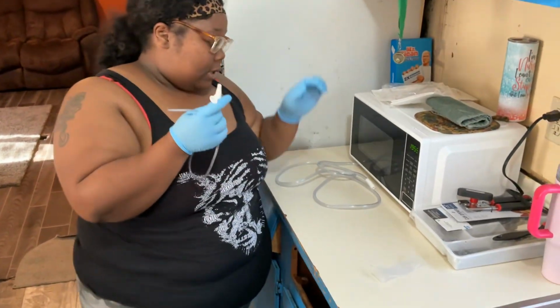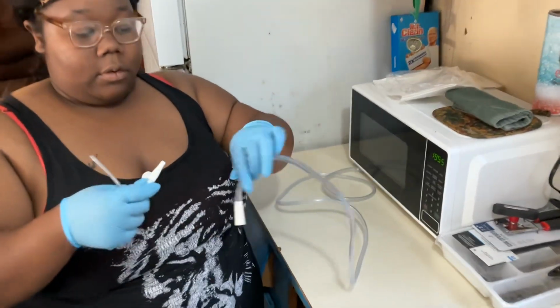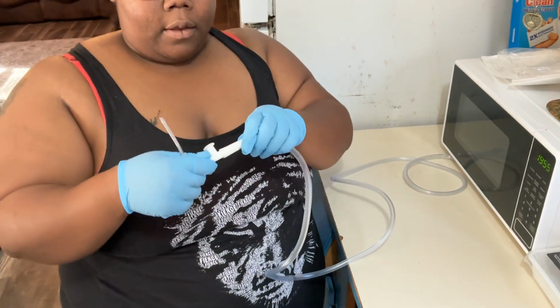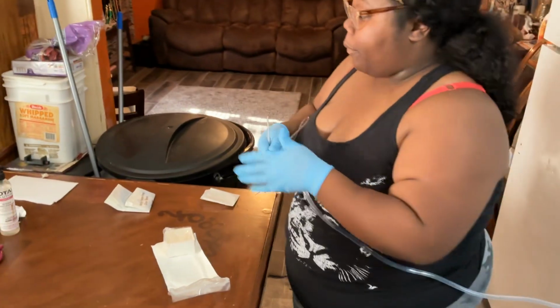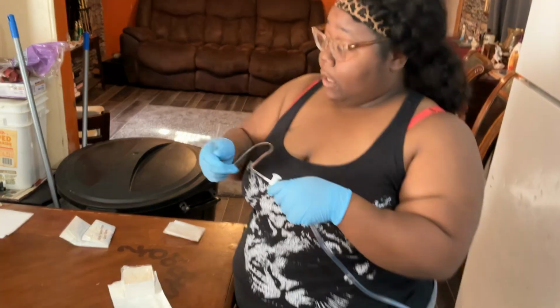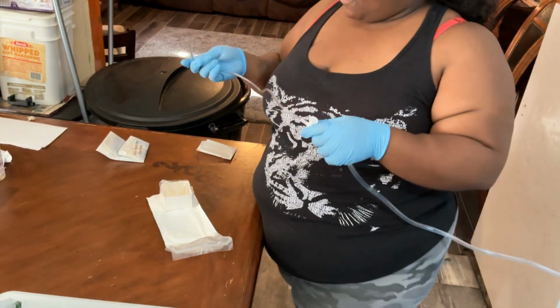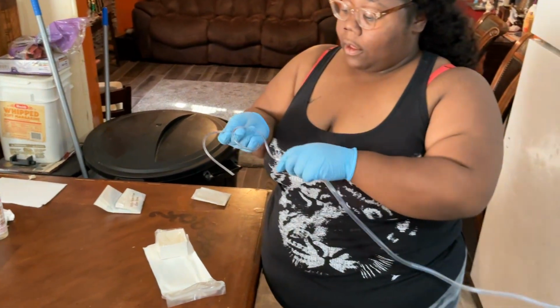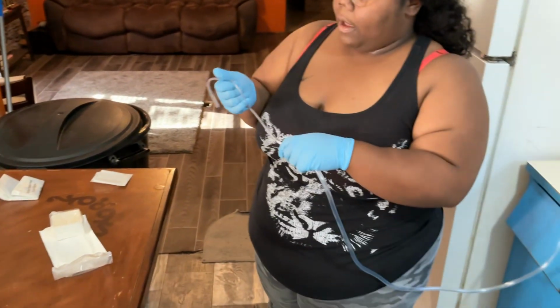I'm going to connect to my suction canister. And I would pour my sterile solution in here to use. Alright, what I'm going to do is take this and wrap it so I can have better control over it. Step back, I'm going to wrap it.